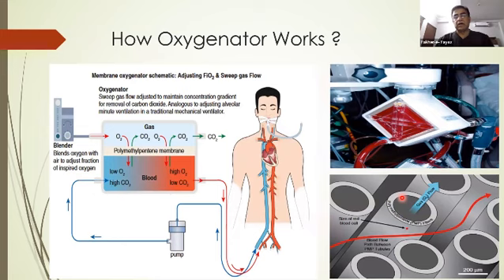See, this concept of ECMO or extracorporeal life support basically initiated in the 1950s, when the heart-lung machine got popularized. Since then, people were trying to put patients on long-term oxygen, heart and lung support, but they were unable to do it because there were a lot of complications. The initial oxygenators were not that good. But now we have got advancement in technology, so we have polymethylpentene fiber, which is basically a long-term fiber that can sustain this flow for so many days.